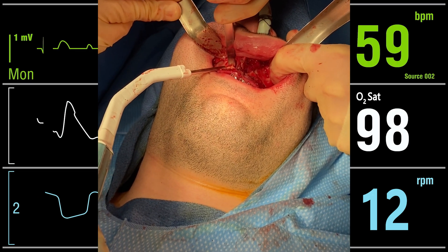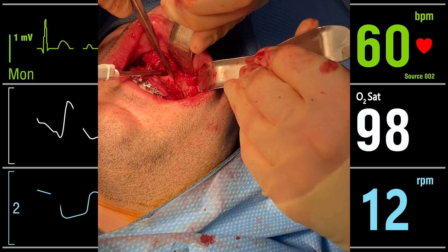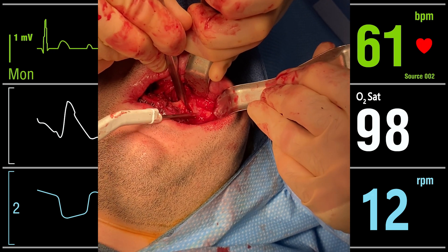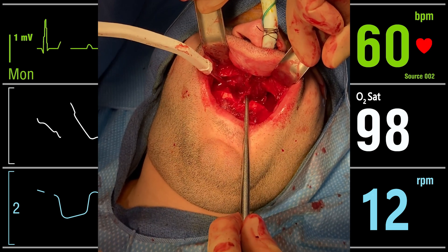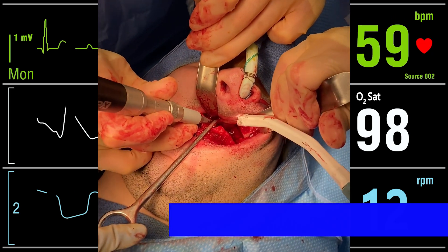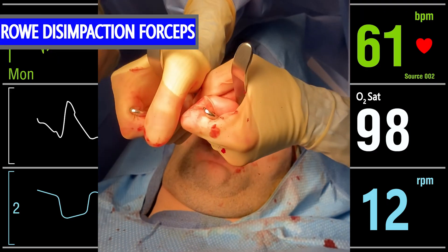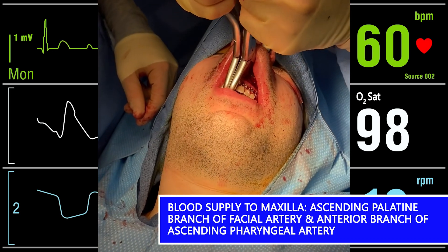I attempted to down fracture the maxilla but there was some resistance, so I got out the osteotomes again. The maxilla subsequently released and became independent of the facial skeleton. I pulled the maxilla inferiorly and removed all bone that will interfere with the planned advancement. I also reduced the midline vomer with a reduction bur to allow plenty of room for the inferior aspect of the nasal septum. I used the Rowe disimpaction forceps to manipulate the maxilla in several planes to free up the tissue and minimize the risk of relapse. The blood supply to the down-fractured segment is the ascending palatine branch of the facial artery and the anterior branch of the ascending pharyngeal artery.